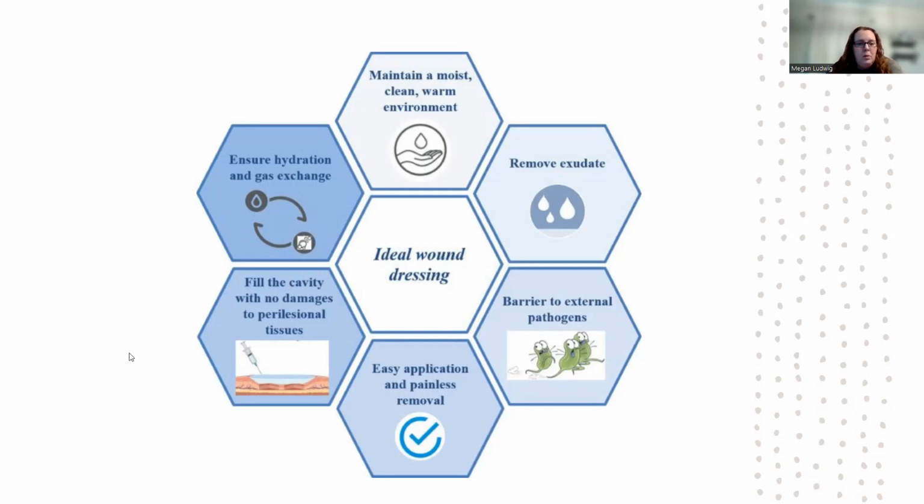So you have to choose the right dressing for the right patient as well. It fills the cavity with no damage to perilesional tissue. And then, like I said before, gas exchange. Sometimes you just need it open to the air.